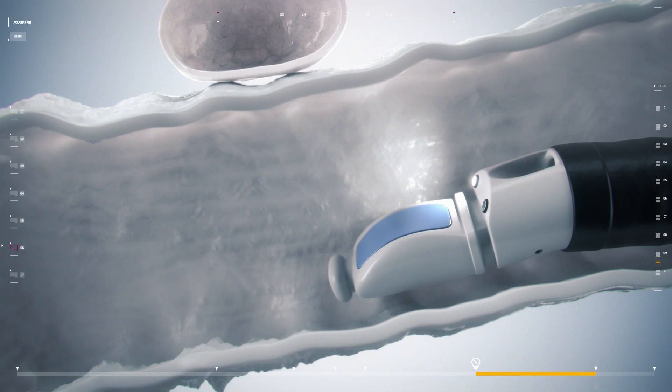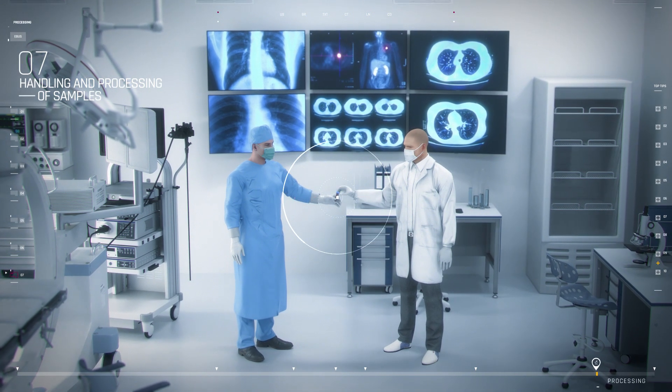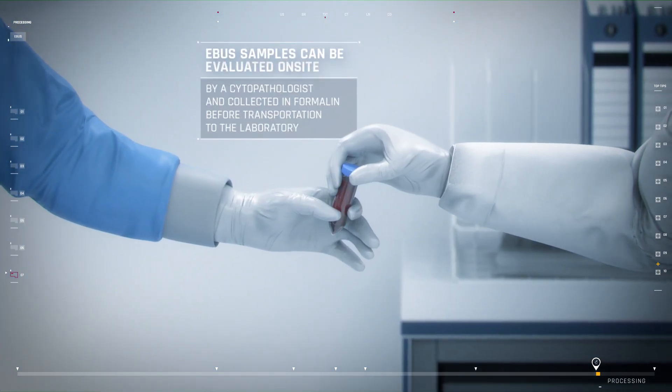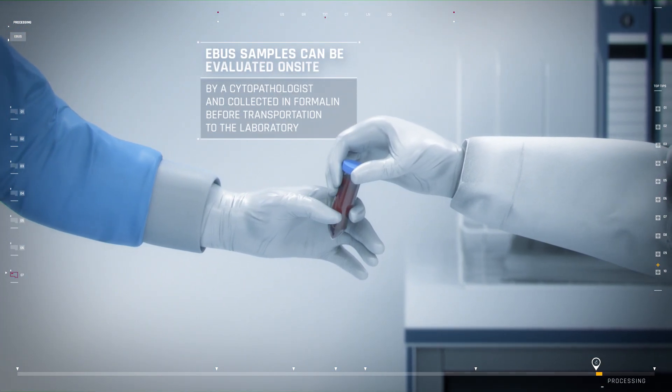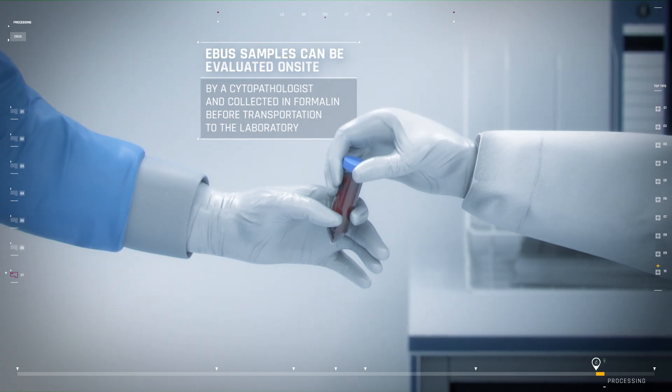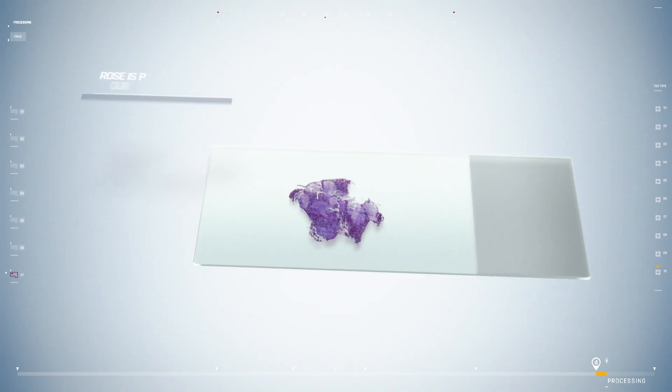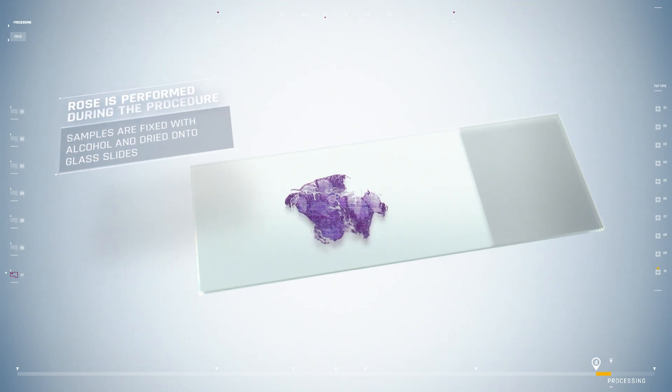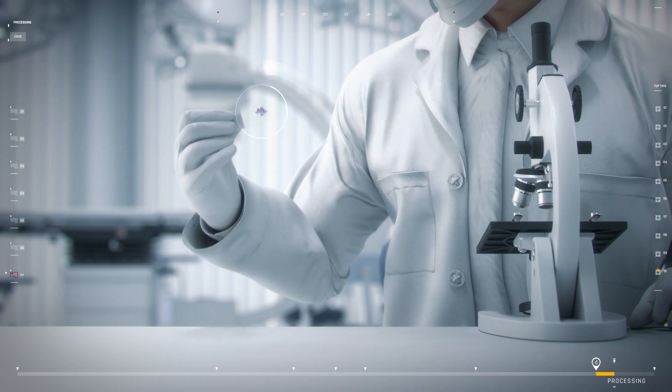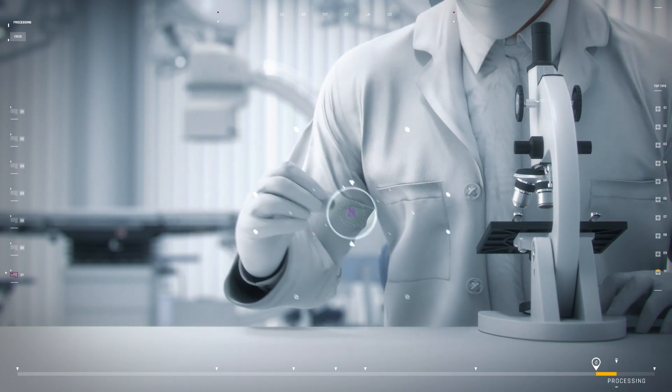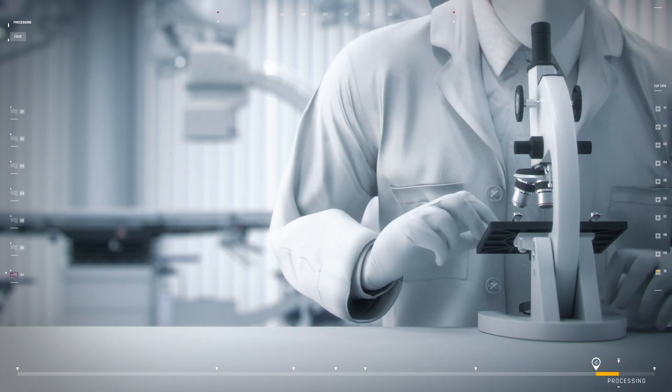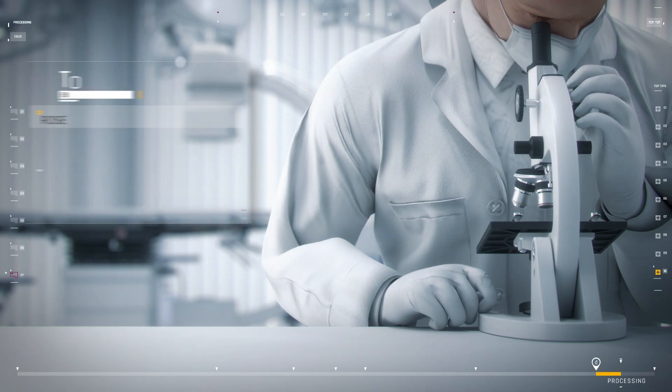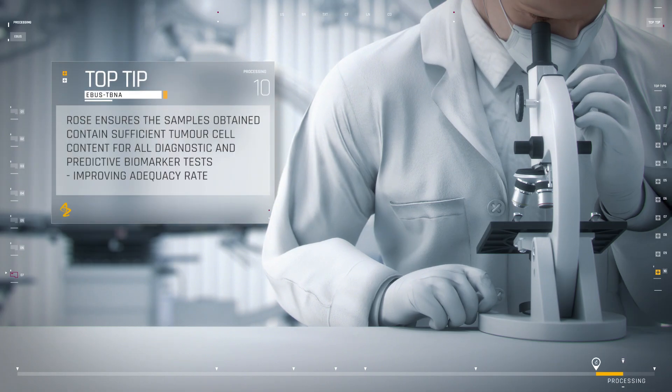The samples obtained may be analyzed on-site using rapid on-site evaluation (ROSE) and are also collected in formalin. For ROSE, aspirated material is smeared onto glass slides, air dried, and fixed in 95% alcohol. Dried smears can be evaluated by an on-site cytopathologist to confirm adequate lymph node sampling with respect to the presence of malignant cells, and in a substantial number of cases, a preliminary diagnosis can be made.